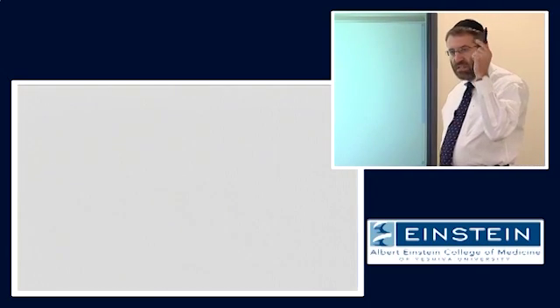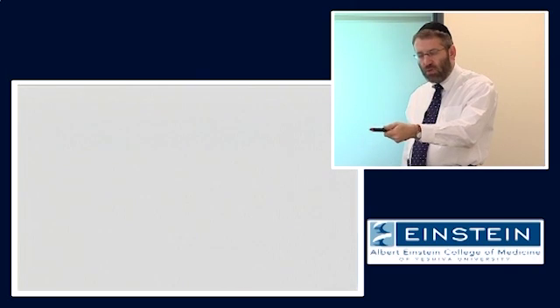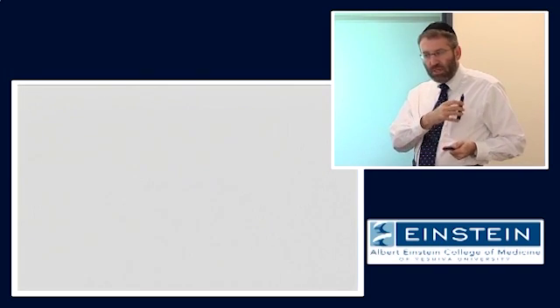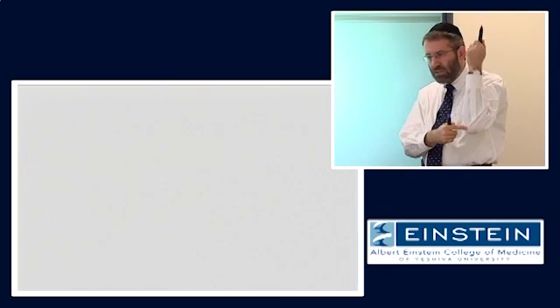So the way I would conceptualize it is when we take the longitudinal magnetization and knock it into the transverse plane, and then turn off the RF once we're at 90 degrees, and wait and watch what's happening. What happens? We have loss of transverse magnetization due to dephasing, and at the same time there is regrowth of longitudinal magnetization. The transverse magnetization loss happens much more rapidly than longitudinal magnetization recovers. If we wait a really long time, like we said at the beginning of the week, 3 to 5 times T1, we will fully recover all of the longitudinal magnetization we started out with.